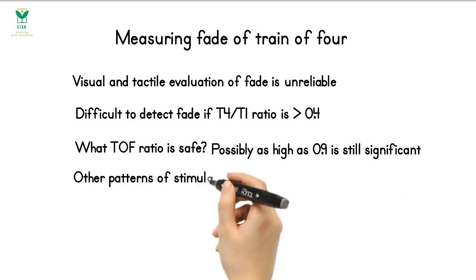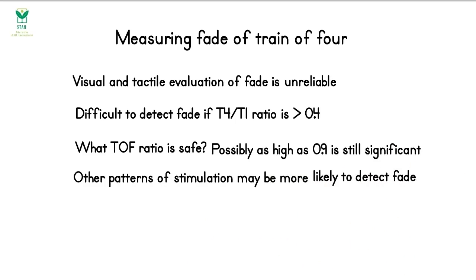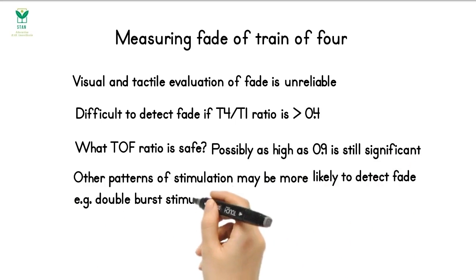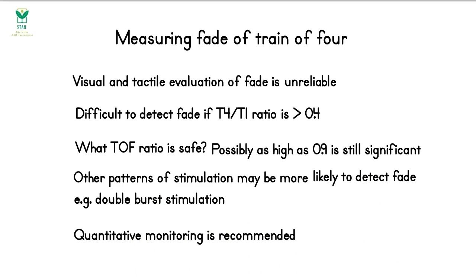Other patterns of neuromuscular junction stimulation may be more likely to detect fade. Double burst stimulation is the most popular of these, but the popularity of train of 4 has never really waned. The RCOA and the Association of Anaesthetists recommend quantitative monitoring as standard rather than visual or tactile, and I'll discuss this a bit.